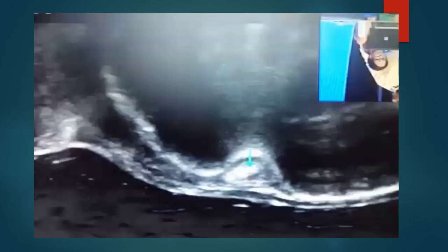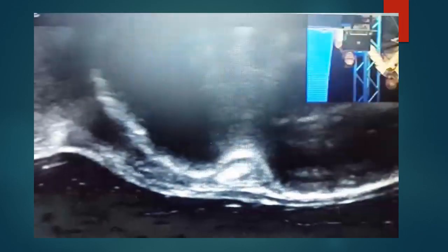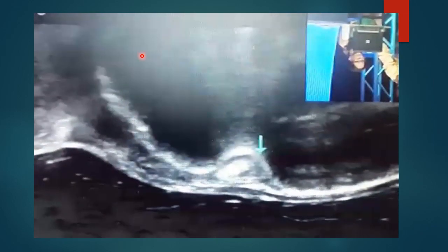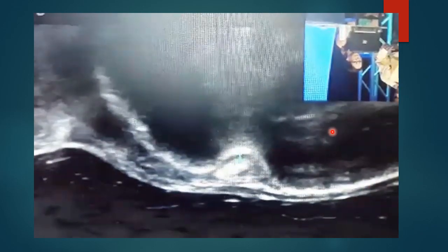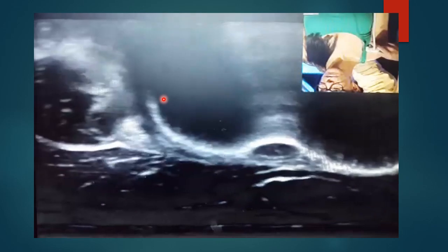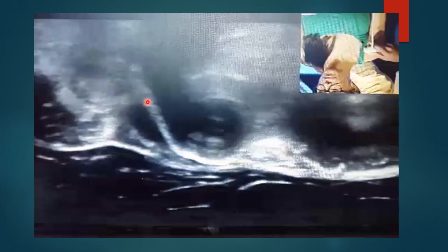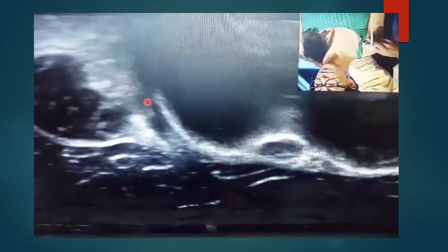This is a video for the examination of the whole technique. This is a TS view of the biceps tendon in the bicipital groove, the lesser tuberosity, the greater tuberosity, the transverse humeral ligament. Medially here is the subscapularis tendon, which is examined properly after external rotation. We notice here that the tendon shows some hypoechoic areas, which is the anisotropy artifact, so as not to be misinterpreted as fluid or tears.